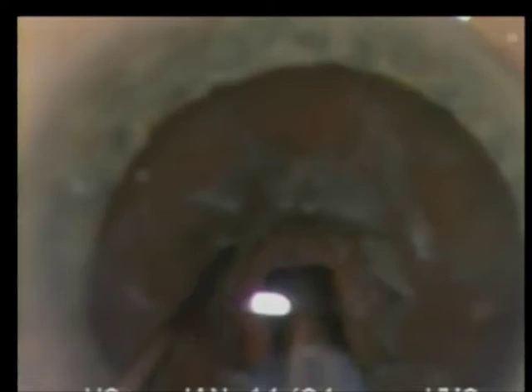A small central crater is established within the lens. My focal distance is at the posterior wall as the sculpting progresses to the posterior pole of the lens. This ensures that I can sculpt safely and deeply and that I am able to thin the posterior plate to facilitate complete fracturing. By utilizing the Series 20,000 Legacy and particularly the 30-degree Kelman bent tip, I quickly emulsify this 4-plus nucleus at a preset ultrasound power of only 60%. Additionally, the bend of the Kelman tip allows me to sculpt deeply into the posterior pole at a very low ultrasound power level.